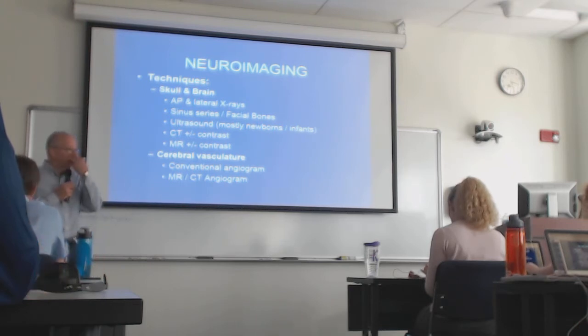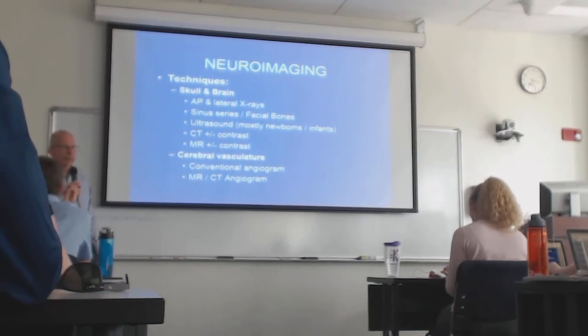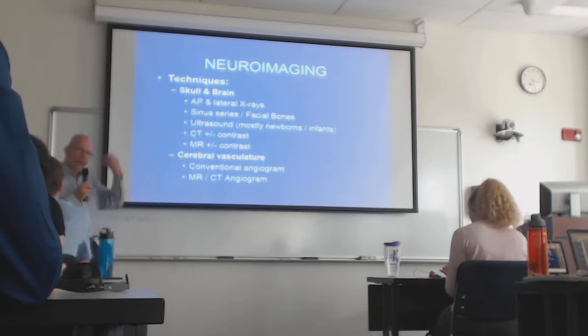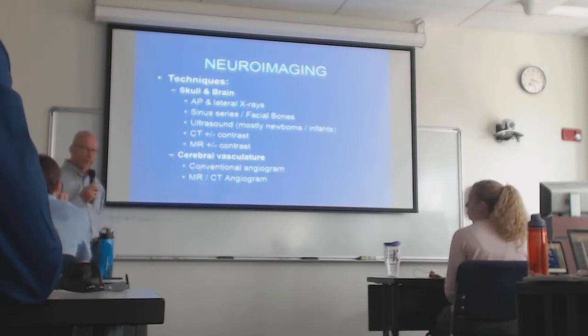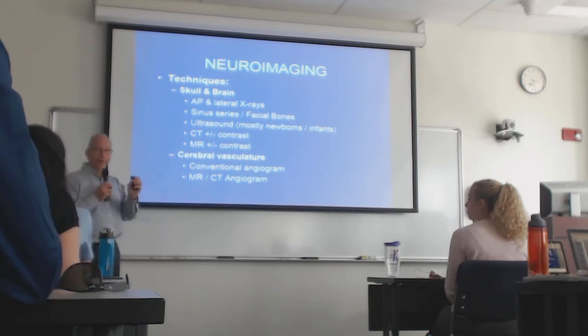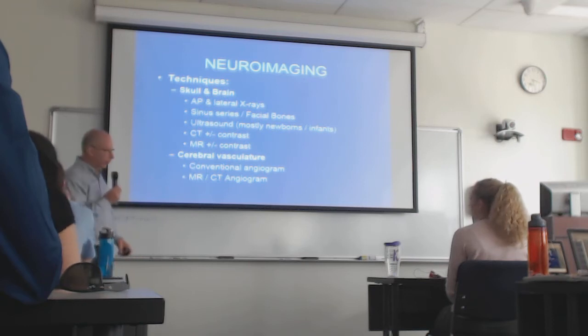Now, I haven't gone into the physics of ultrasound very much, and I will not. But clearly, you would think that bone is not a great window for ultrasound, that it would block all the ultrasound waves, and it actually does, except when you're a newborn, you got this hole in the top of your skull called the anterior fontanelle, where the skull bones haven't fused yet. You've also got one in the back. And if you're a really good sonographer, you can find a little hole on the side, and you can direct an ultrasound beam through that hole and see the intracranial anatomy of a newborn absolutely beautifully.